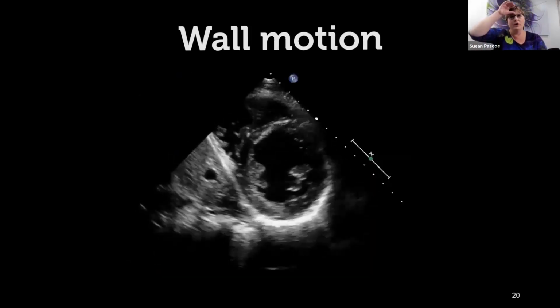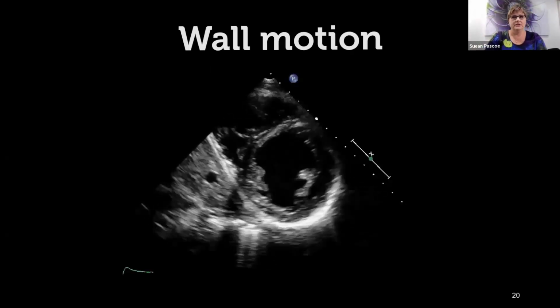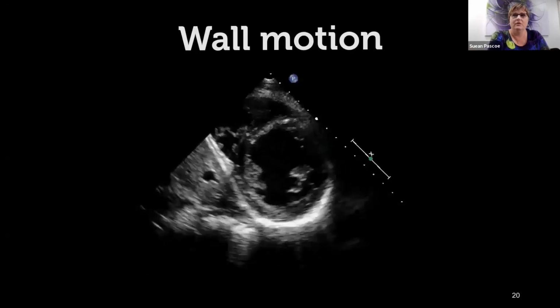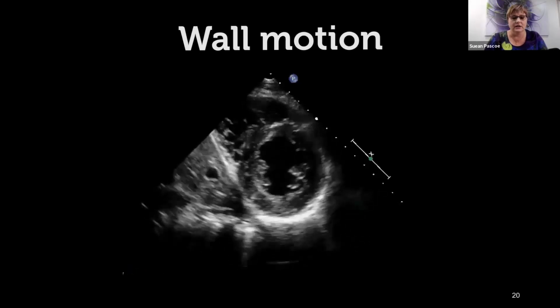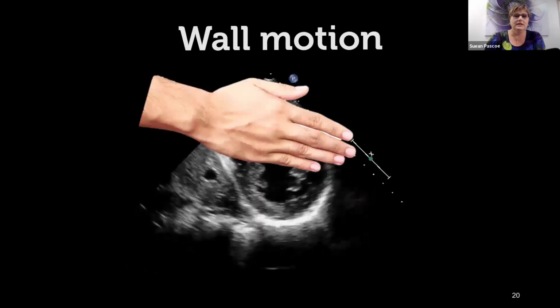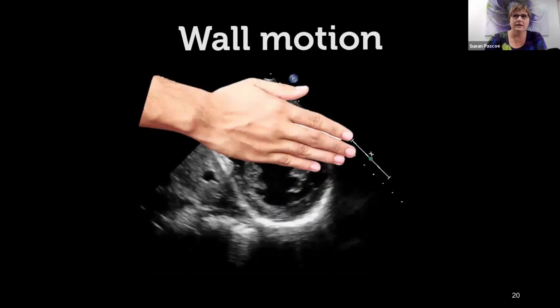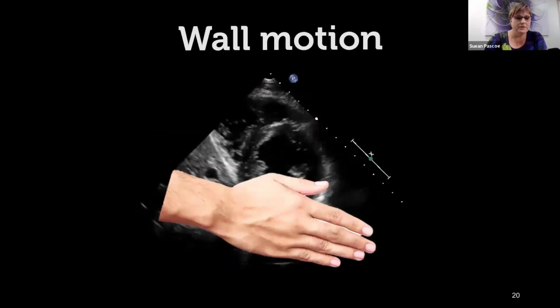Now, when I look at wall motion, I personally find it a bit tricky, and maybe I just haven't done thousands and thousands of them like the echo sonographers have. But I find it tricky to figure out, well, which side of the heart is actually not moving properly. And so what I tend to do is, again, cover up half the thing. Is that side of the heart moving when I've covered it? Cover the other side. Is the top side moving?